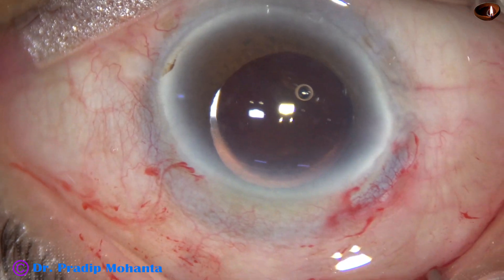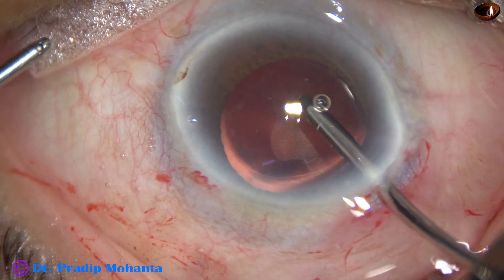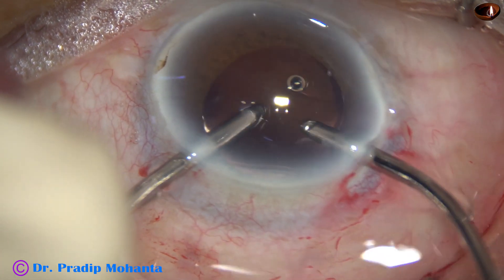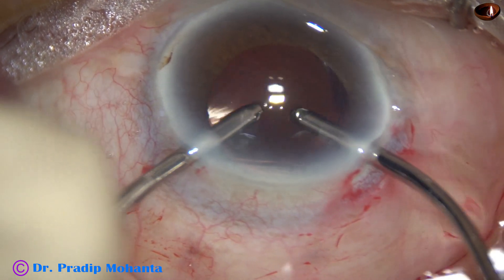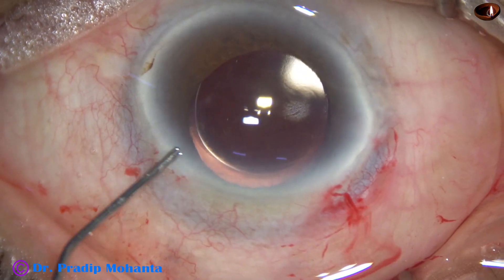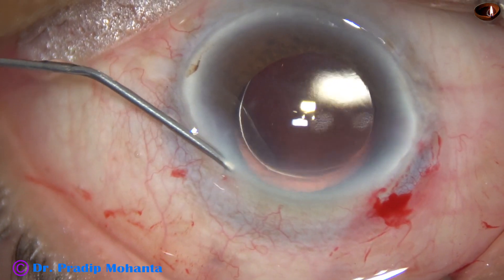And now I take the bimanual I/A. I have only two ports, so I go with the irrigating port through the main wound. At this time, I lift the anterior wall of the main wound a bit and the anterior chamber is maintained. Aspiration is done intermittently so that the anterior chamber doesn't become shallow. This is a bit of moxifloxacin, and now the side port is closed by hydrating the corneal stroma.